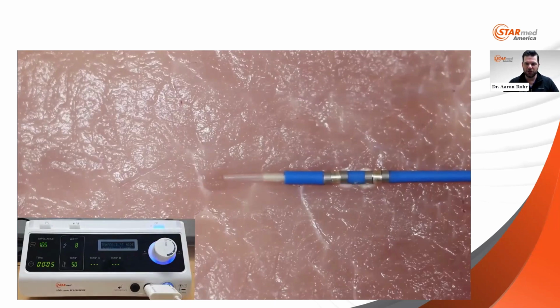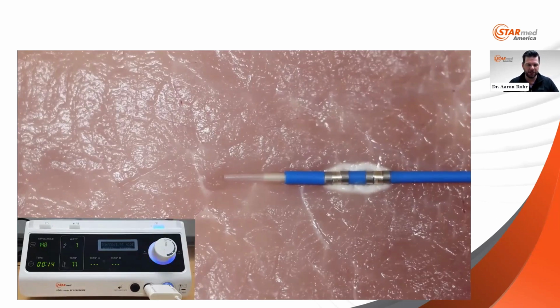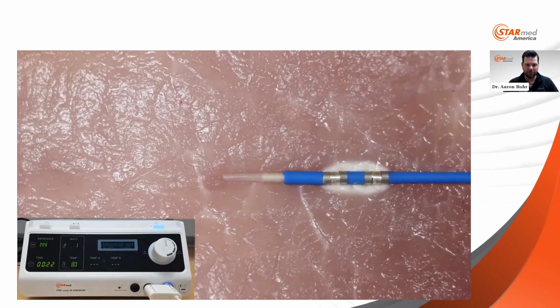So as you can see, between what are radiopaque markers there on the catheter, this is the smaller of the aforementioned. So this is the 11 millimeter, I believe. But as you can see, the wattage and temperature are going to vary greatly in order to get your general averages for the impedance. As we go through time, we're getting the response we want. It's a very focal ovoid response for the actual stricture ablation.